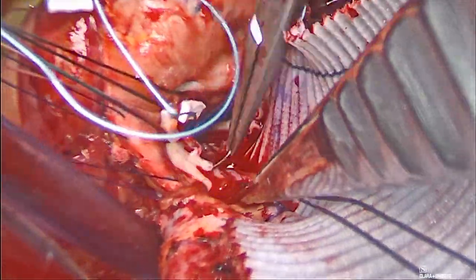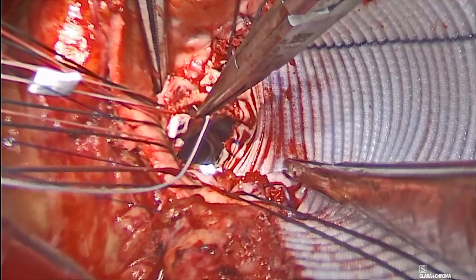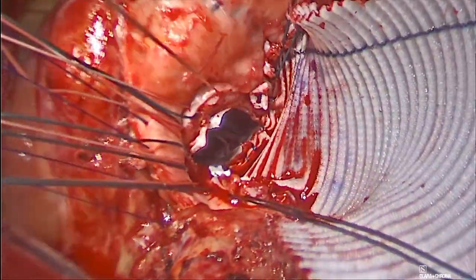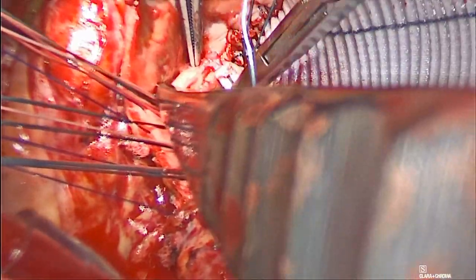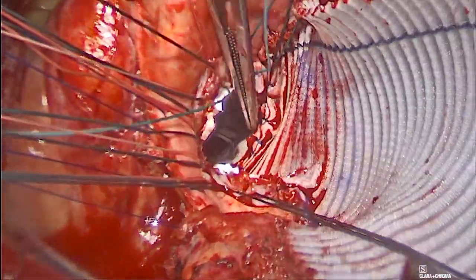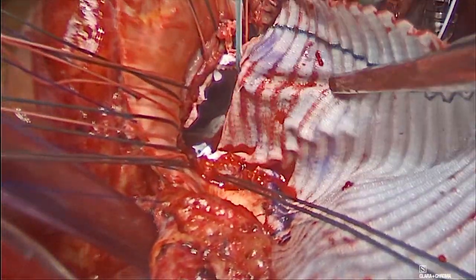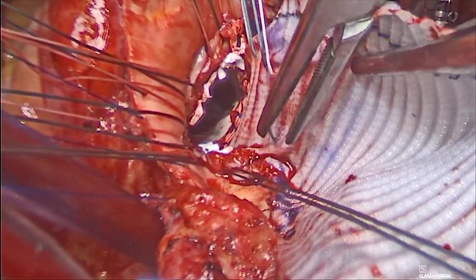A series of pledgeted horizontal mattress stitches were placed around the annulus, starting with the left coronary cusp, followed by the right coronary cusp, and then through the enlargement area from outside to inside of the patch.